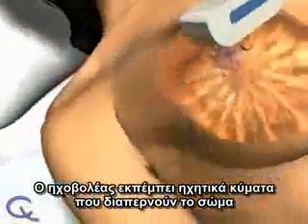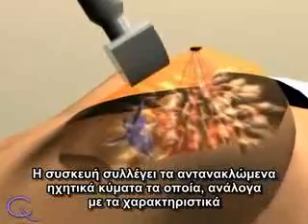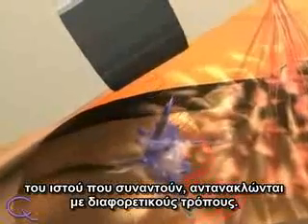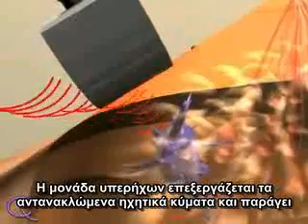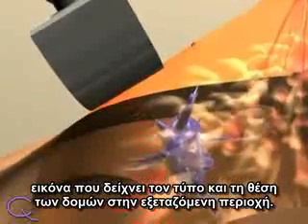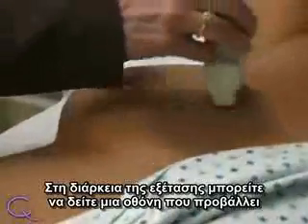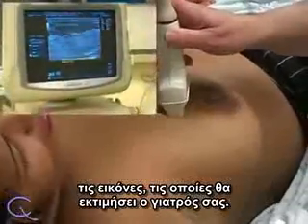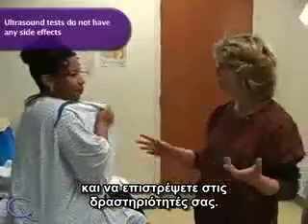The transducer emits sound waves that travel through the body and reflect off of internal structures. It collects the reflected waves, which, depending on the characteristics of the tissue encountered, bounce off in different ways. The ultrasound unit then processes the reflected waves and produces an image that shows the type and location of structures in that area. During the exam, you may be able to see a screen displaying the images that your doctor will evaluate. Once the exam is over, you can remove the gel and resume your normal daily activities.